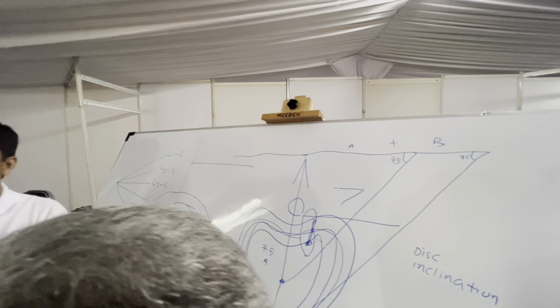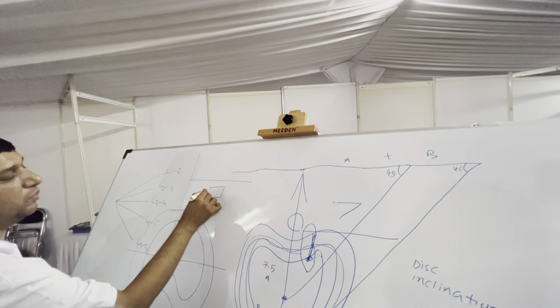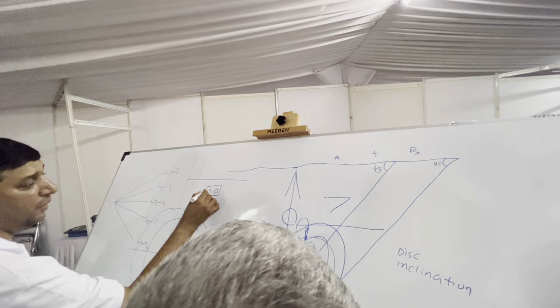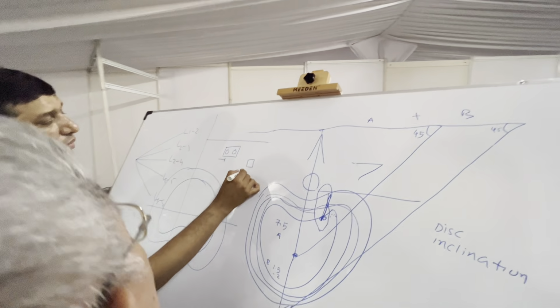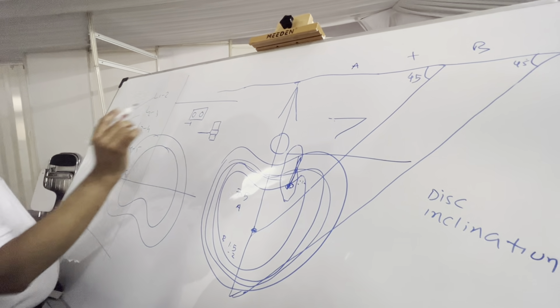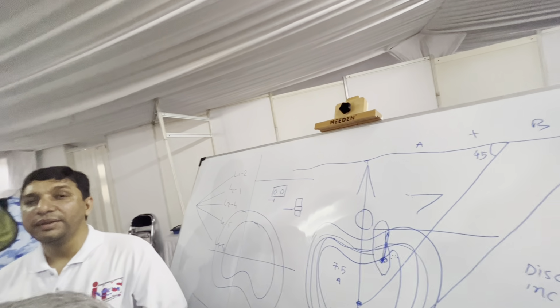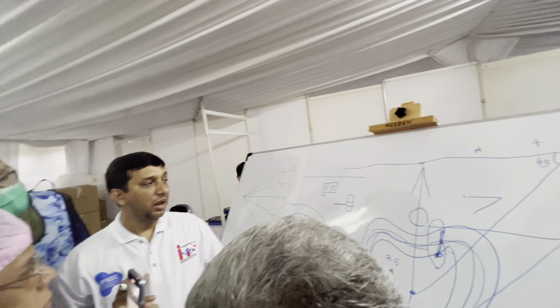When you see the AP view, you see this is a pedicle. So the needle is at the medial pedicular line, and in the lateral view, it has to be at the posterior vertebral line. If you follow this principle, my friend, you will never fail, because this is the safest way. This angle is the safest angle.